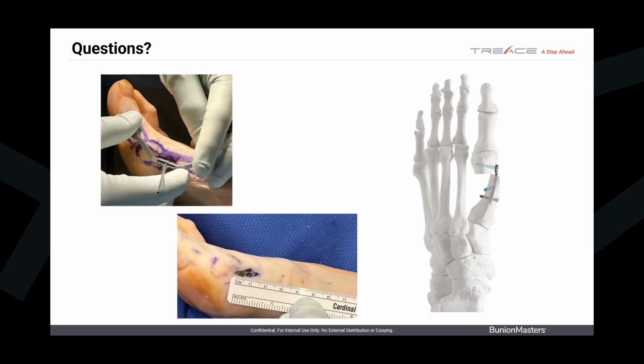There is, I mean, really, really large IMs. You can't get this osteotomy greater than 100% correction. And in order for the plate to be in contact with the head, it's got to be about 90%. So I think the Nanoplasty is the perfect procedure for that 11 to 14 range. And anything larger than that, if you're comfortable with Percuplasty, that'll fill that gap. If not, the Lapiplasty is the best option in that situation.